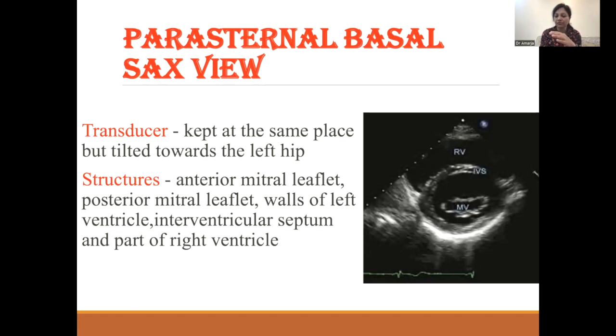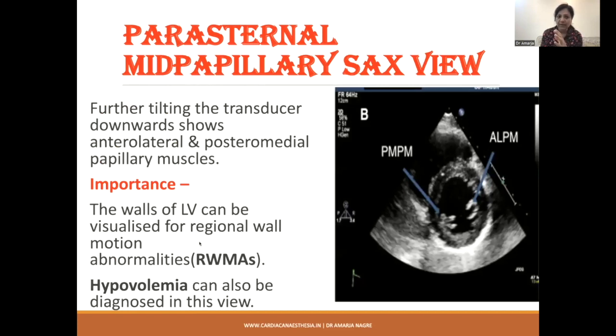Now what you do, you tilt further towards the left hip, that is downwards, and you see the inside of the LV. Okay, so when you see the inside of the LV, what you see now, the base, that is the mitral valve, is seen. Now you see the papillary muscles. So this is the anterolateral papillary muscle. This is the posteromedial papillary muscle. Okay. There is a lot of importance to this view.